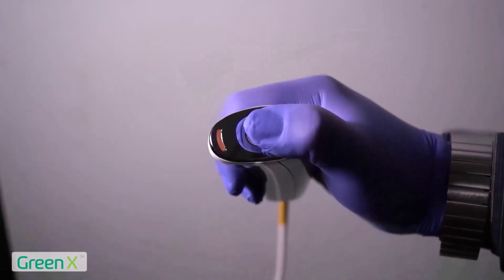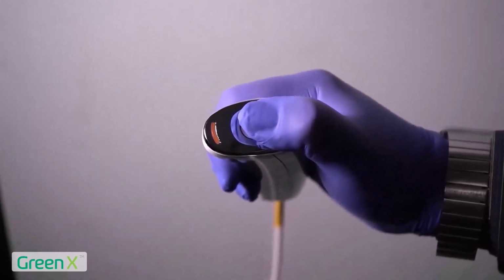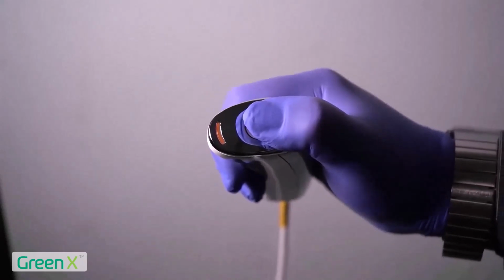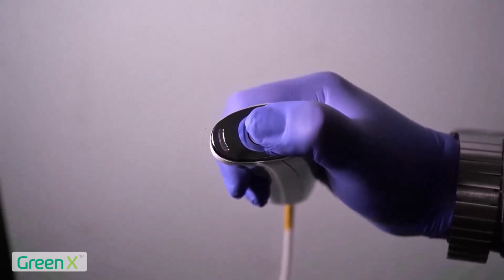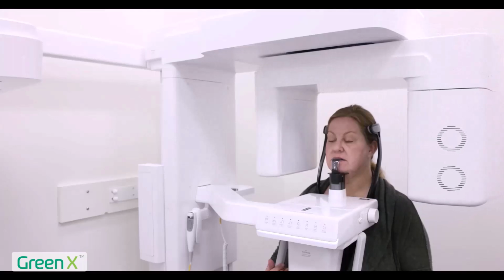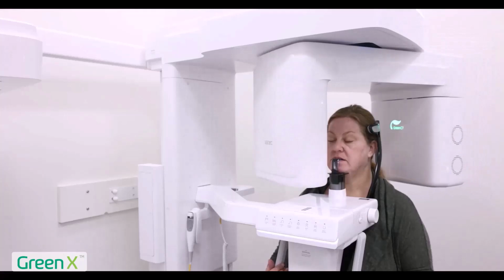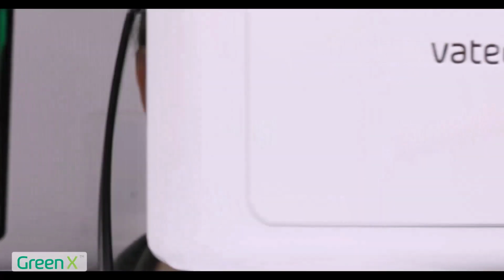Hold the button on the acquisition trigger switch, which will turn yellow when exposing. Hold the button until the image acquisition is fully complete. Image capturing is complete. Please wait a moment. Patient safety is our top priority, and we are a radiation-safe dental clinic that uses a low-dose CT. Please wait a moment.